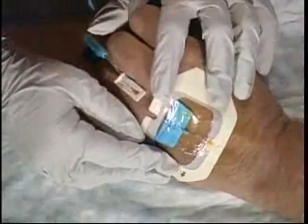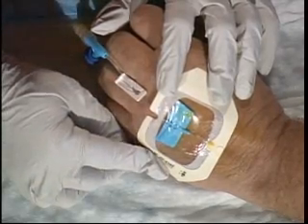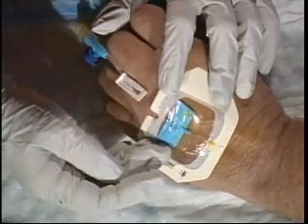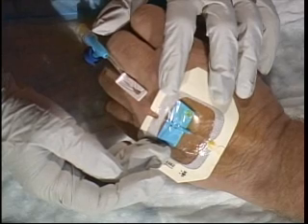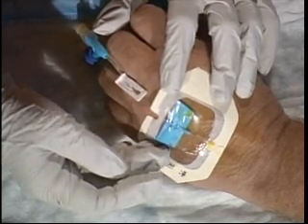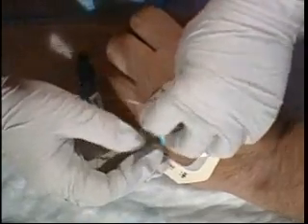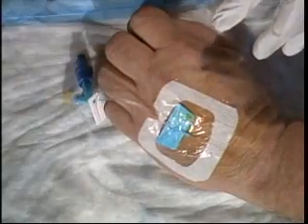Now I put on my transparent dressing. The transparent dressing allows you, as the clinician, to perform daily site inspections. I can see the venipuncture site without taking down dressings and causing further skin irritations with tapes being removed all the time. I can also warn the patient of what to look for should there be a particular problem with the IV. And this falls under not only your documentation, but your patient education pieces.